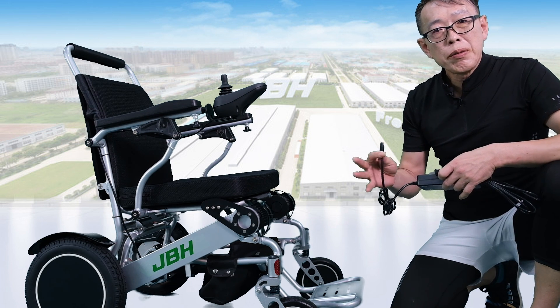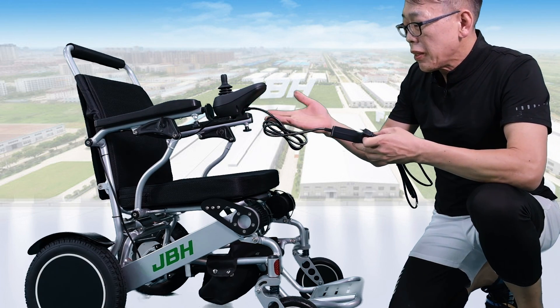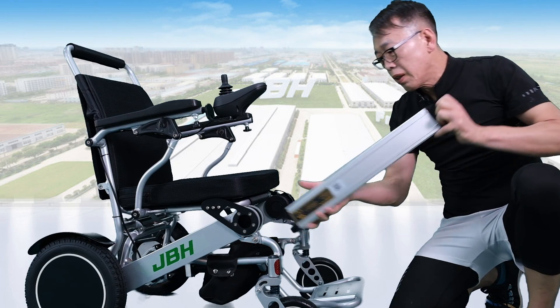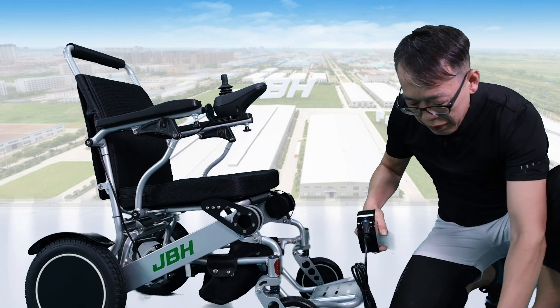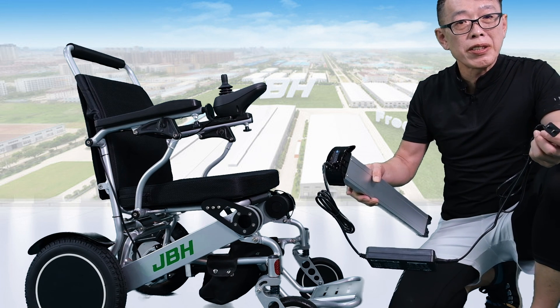There are two ways of charging the battery. One is to directly plug in here from the joystick — you can connect the power source. The other way is to take out the battery; we need to plug in here, and that allows you to take it away from the wheelchair for any convenient way of charging.